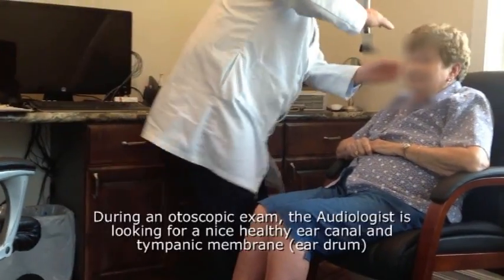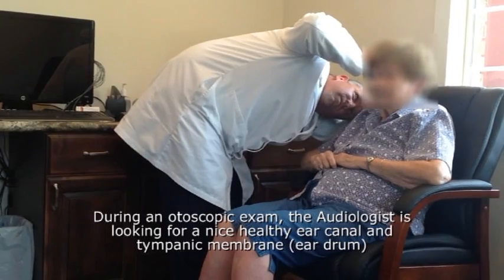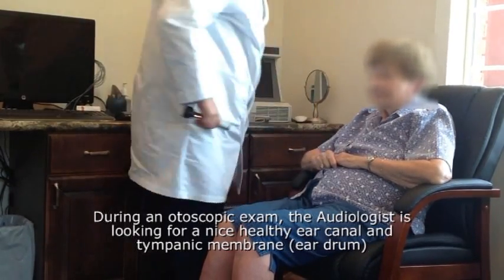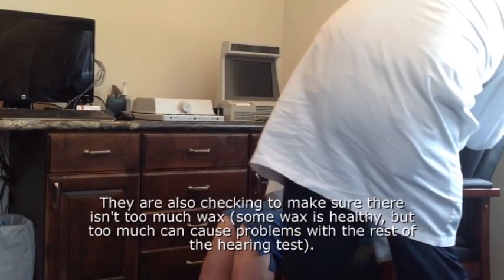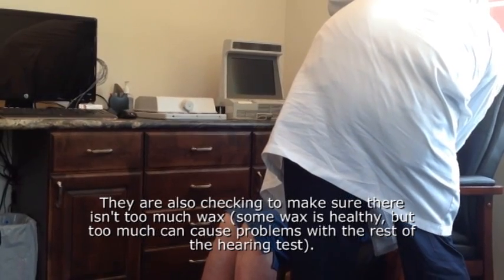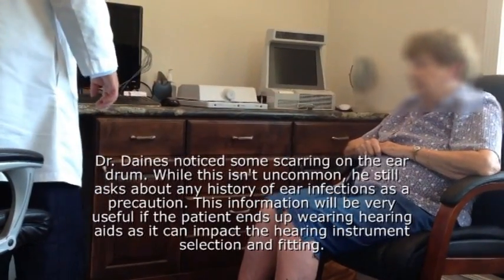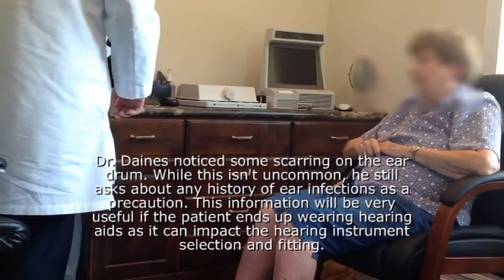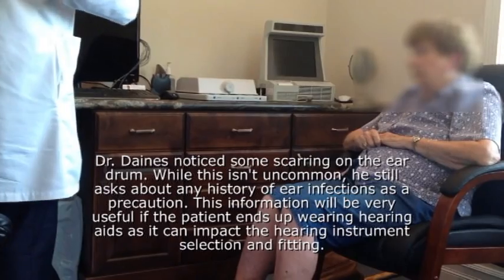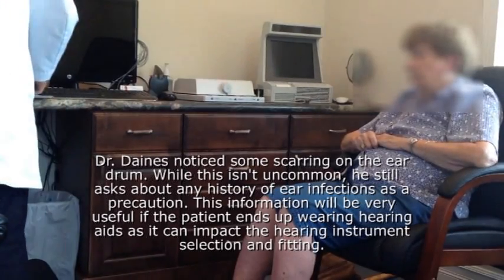Okay, let me take a peek in there. That eardrum looks great. Got a little bit of wax, but not very much at all. Looks good too. Did you have any ear infections when you were young? Do you remember? A little bit of scarring right on the very top of the eardrum. Looks like maybe at some point your eardrum was broken, but it looks fine now.